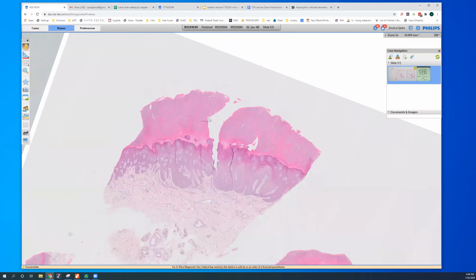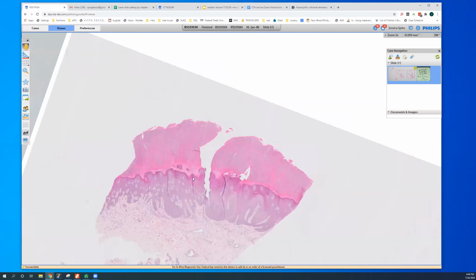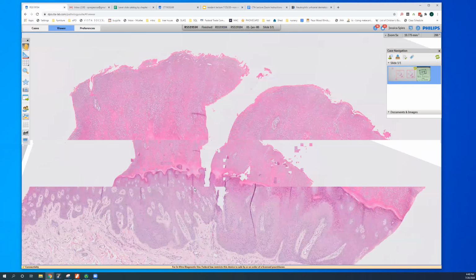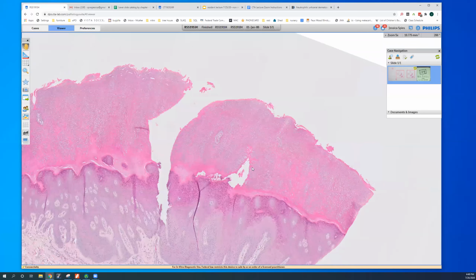Okay, so actually the key to the diagnosis is not here, but if we just have this, and we said this is an acral site because we don't really have hair follicles or anything, what would this be? We just went over this in our chapter. LSC, exactly.